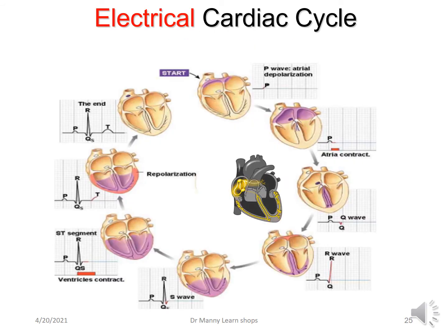When we look at the heart, we look at the cardiac cycles. And essentially, there are 2 cardiac cycles. The one that we're looking at today is really the electrical cardiac cycle. And it's the electrical cardiac cycle that results in depolarization and repolarization of the atrial and ventricular myocardium. And this creates now the ability for the heart to pump blood. But this is electrical, and this is the one that we're measuring here today in the electrocardiograph.